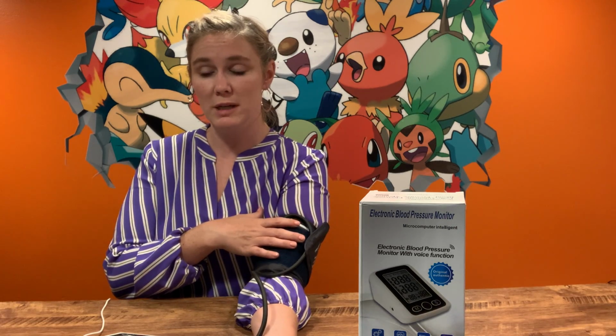You just lay your arm down at a 90 degree angle. You want to sit still. And it starts to squeeze my arm tightly. You just let it go. A good reading is 120 over 80.